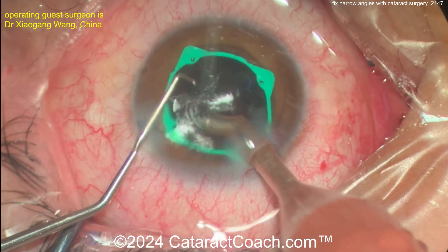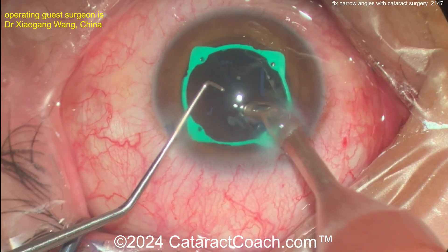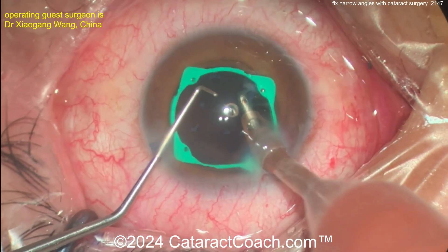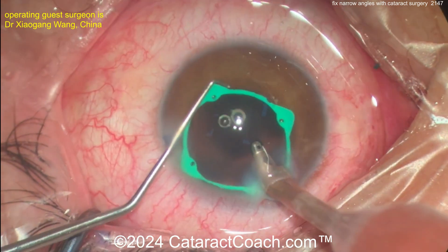Putting that thin IOL in is really just a magical treatment. You can see the comparison of before and after — I'll show you the post-op OCT of the anterior segment, and you'll see it's a wide-open angle.